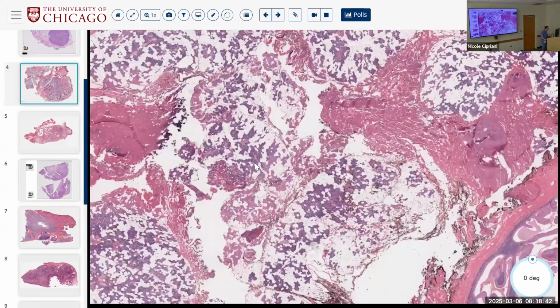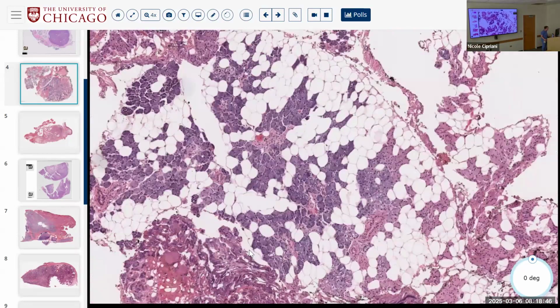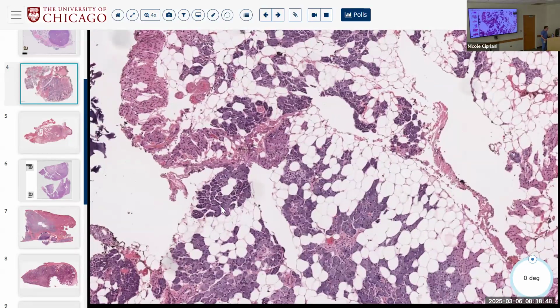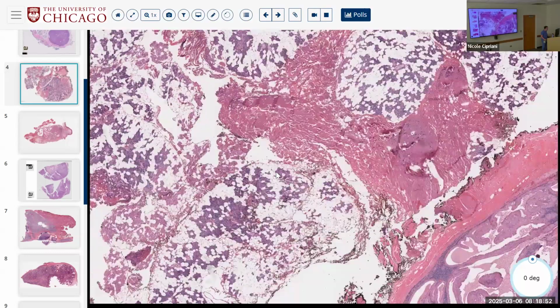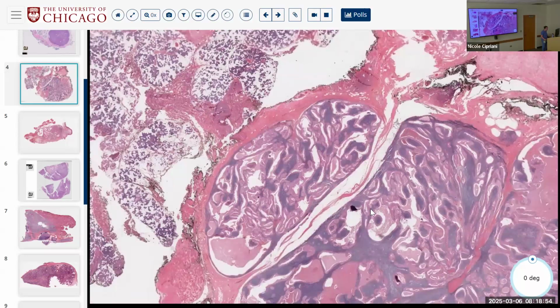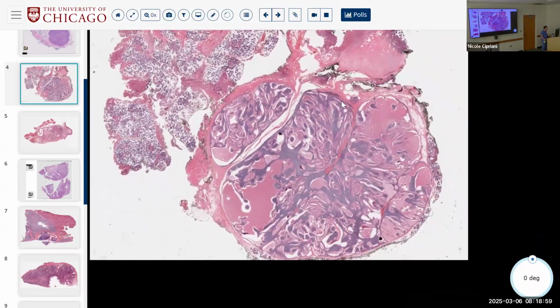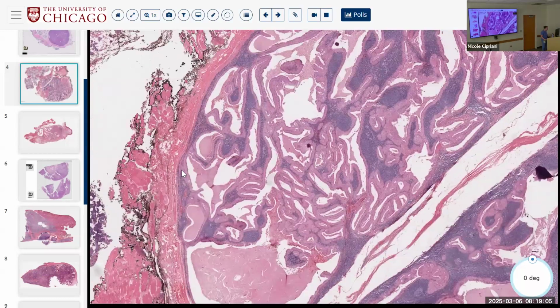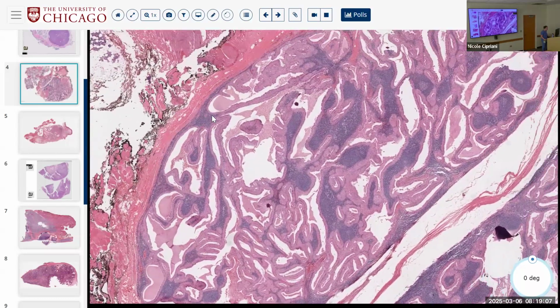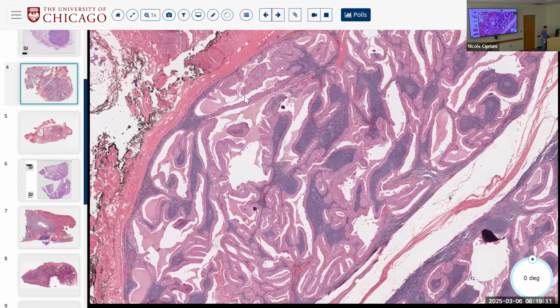Just looking up here. What gland we're in. So it looks like we have mostly serous, so we're in parotid. And the lesion over here is well circumscribed, lobulated. You definitely see that there are some very pink cells and also a very deep background.